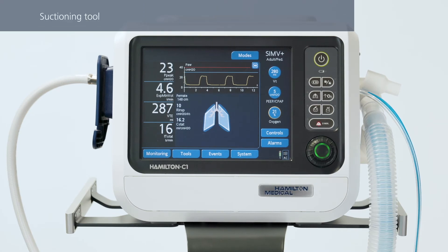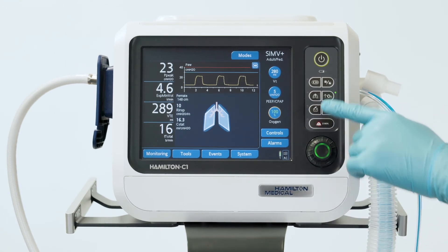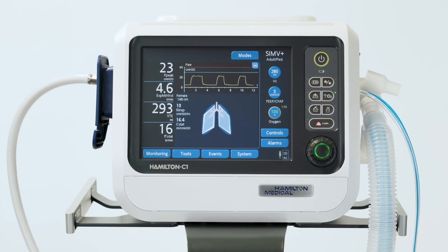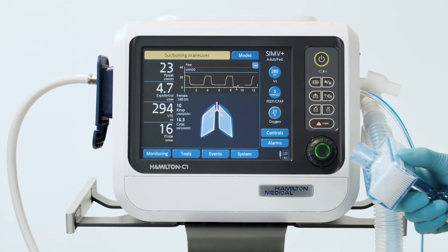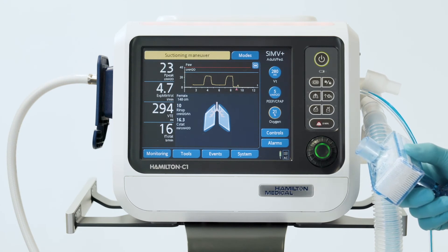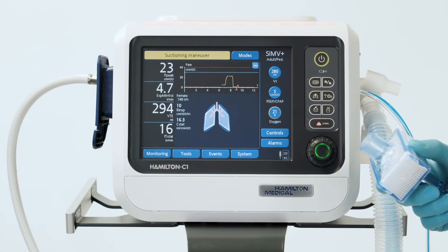You can also use the O2 enrichment key to help you perform suctioning maneuvers. This function not only makes suctioning easier, but ensures the patient's safety and protects the operator from possible contamination as well. Start by pressing the oxygen enrichment key for pre-oxygenation. The oxygen concentration increases for a maximum of 2 minutes. As soon as you disconnect the patient for the suctioning maneuver, ventilation stops automatically. No gases are blown through the tubes, so you are protected from possible contamination, and alarms remain suppressed for one minute.